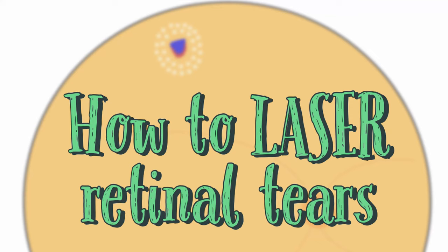Do you want to know how to treat a retinal tear with laser? Then this is the video for you.